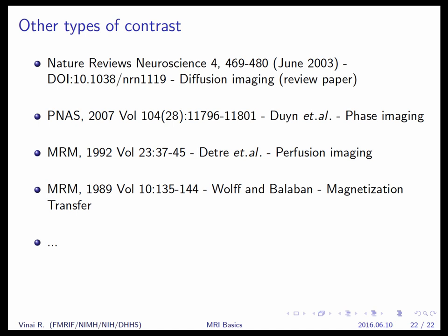So you're saying the measurement of the amplitude at that sweet spot? Exactly. Is it the measurement at a sweet spot, or the rate of the whole curve? It's just at the sweet spot, or at whatever timing parameters you choose in the sequence. But you try to choose your parameters to enhance the contrast that you're looking for in that particular experiment. So you can choose a super short TE that is more proton density, because then all the spins have the same signal, and it's just based on the proton density, how many are there. That makes sense.